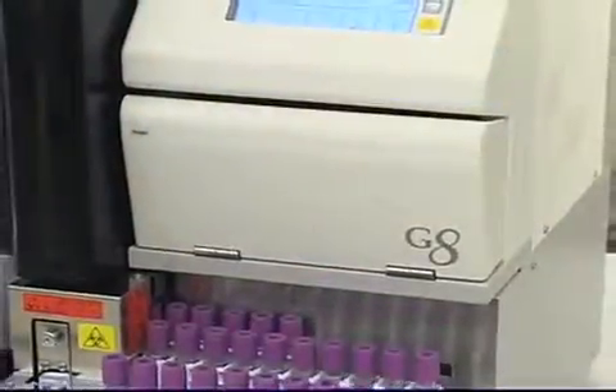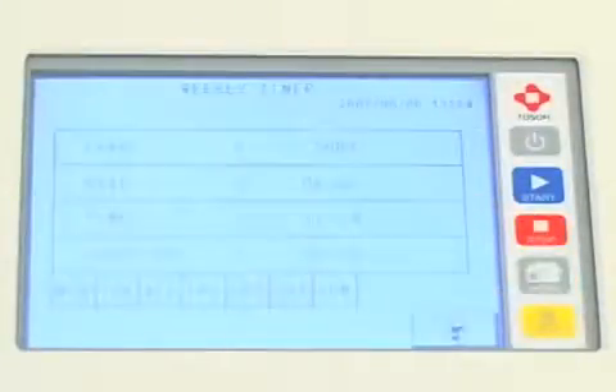Daily start-up is quick. In fact, the Tosoh G8 can be programmed to power on automatically at any time, on any day of the week.